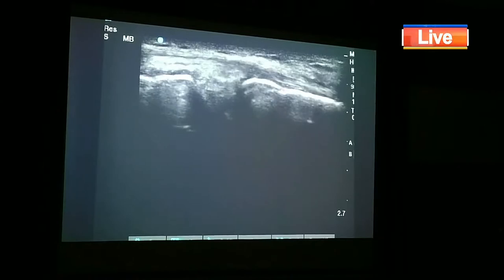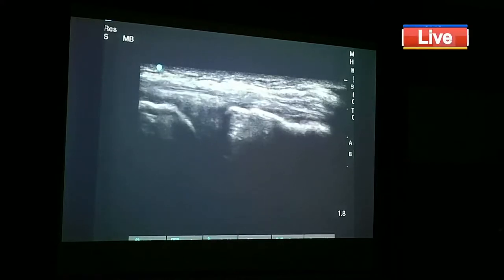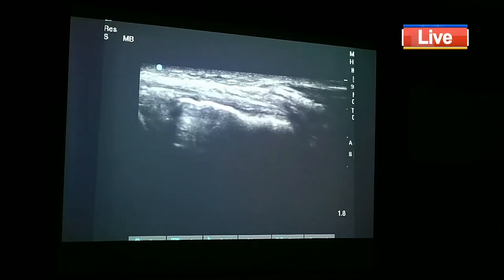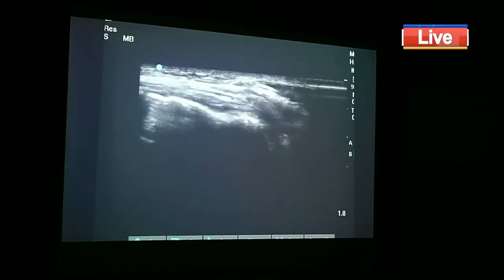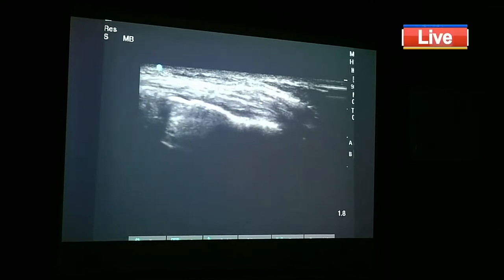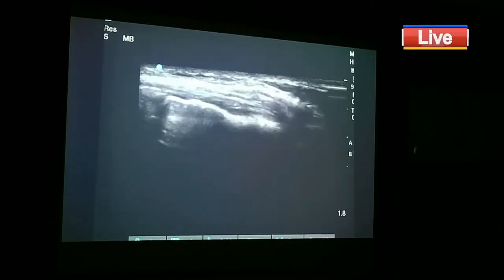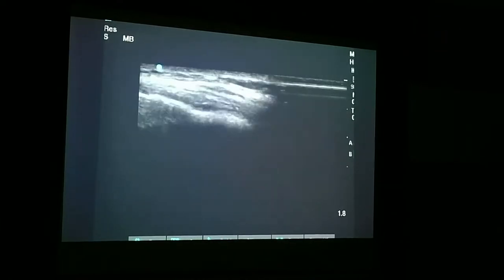So now you remember you saw the tibia like this. The only thing is now you can also see these ligament fibers very nicely, the collateral ligament, and they are going down. Now why I am telling you this is because the genicular vessels are very close to this ligament at the time of its insertion. Okay, so you very smartly go very close to the insertion of this ligament and you will find the junction also there, that is the epiphysis metaphysis junction, and you will also find the vessels there.